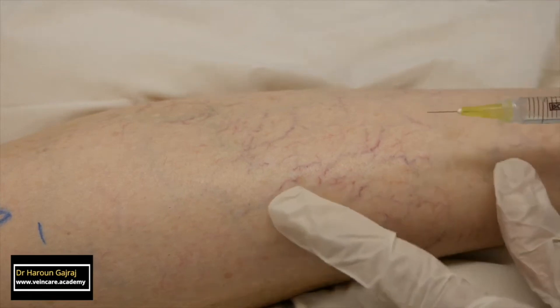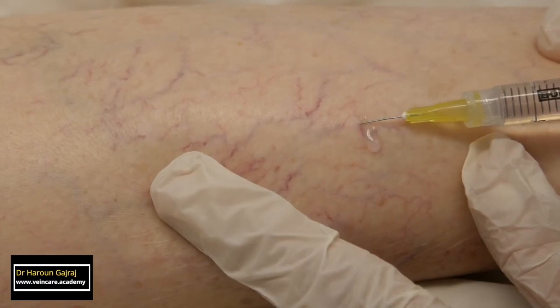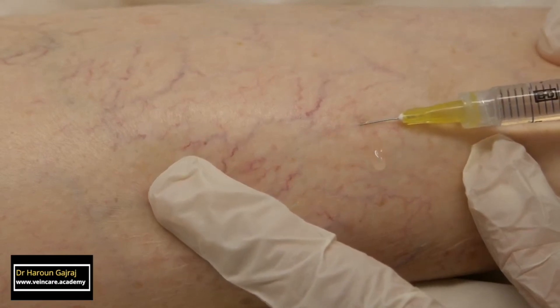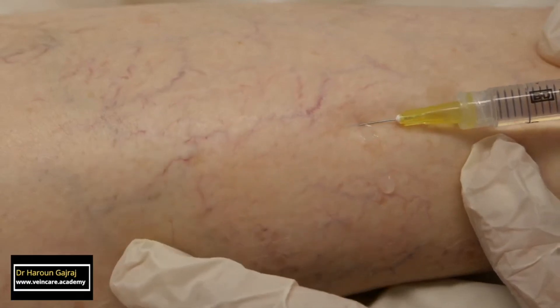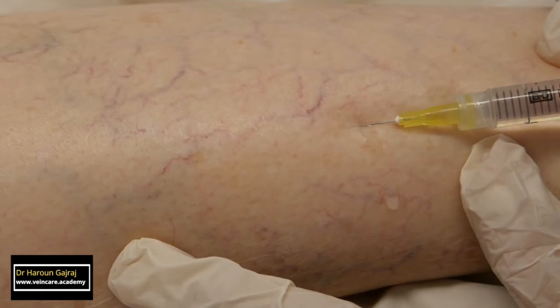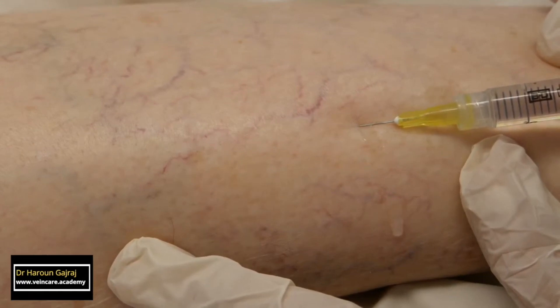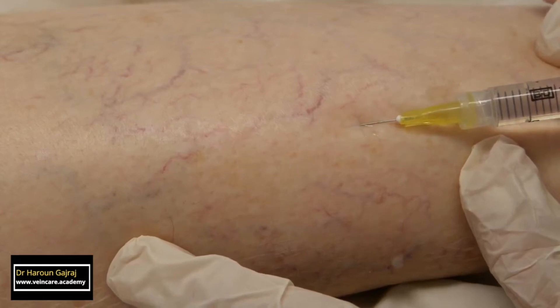I am checking that the needle is positioned such that the bevel is uppermost. Once again, I apply a little pressure on the piston of the syringe as I advance the needle. A few drops of sclerosant solution leave the needle before the skin is actually punctured. Sclerosant dripping onto the skin doesn't cause any problems — keratinised squamous epithelium is not damaged by sclerosant.